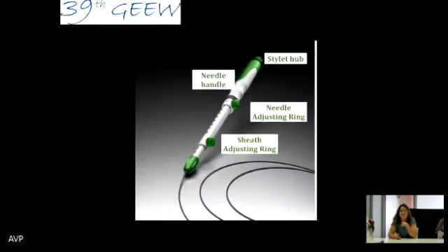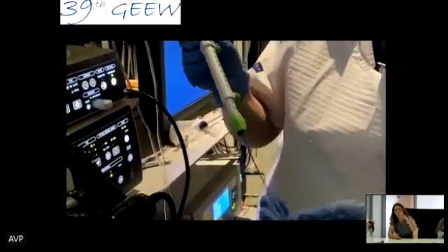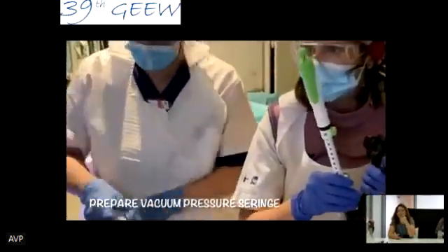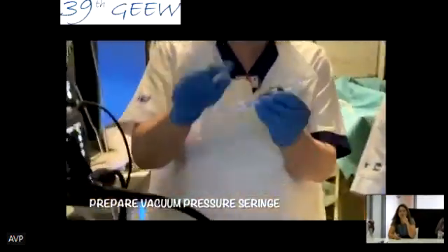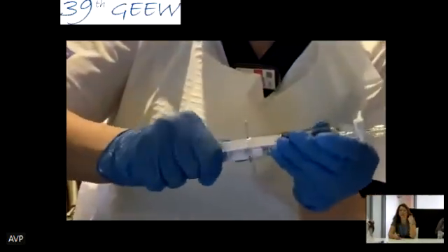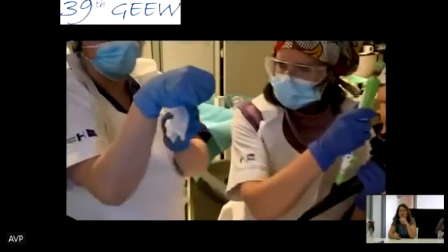So here, this is one example of an FNB needle. You have a sheath adjusting ring and the needle adjusting ring that you can use to take a bit out of your plastic sheath. And then the other knob is to release the needle. So we prepare a vacuum pressure syringe like that. We bring back the air when it's closed, so you have vacuum already inside.